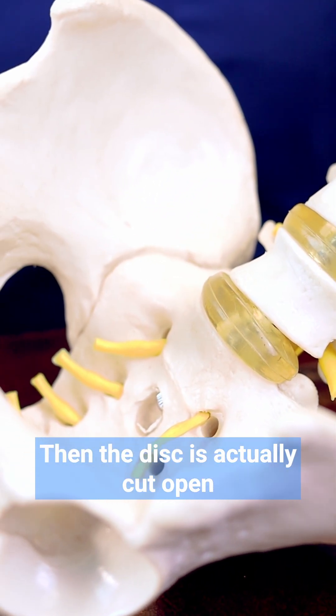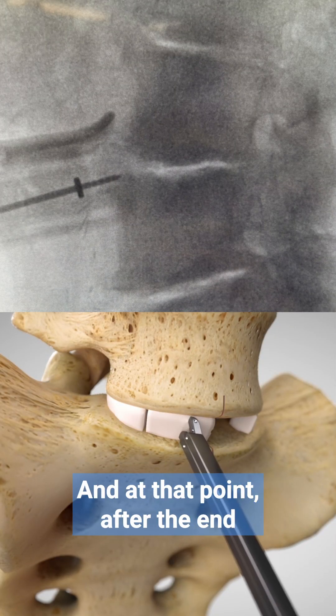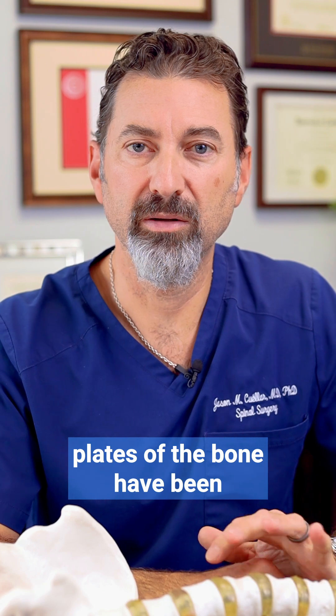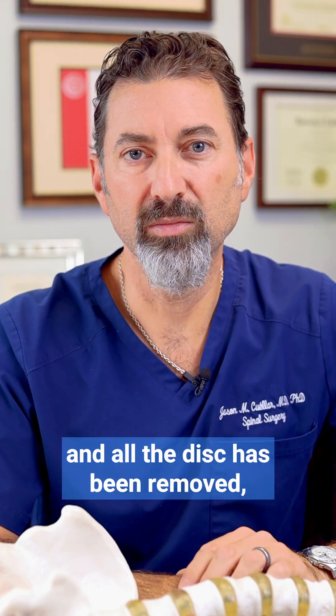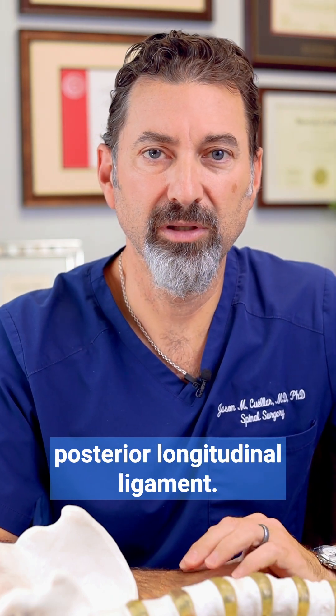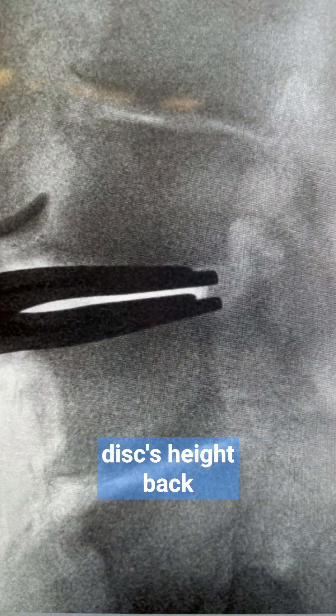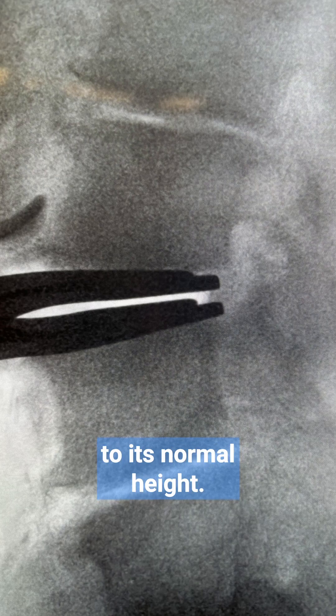Then the disc is actually cut open and removed. After the end plates of the bone have been completely cleaned up and all the disc has been removed, I often have to remove part of the posterior longitudinal ligament. This is a ligamentous release that allows me to restore a collapsed disc's height back to its normal height.